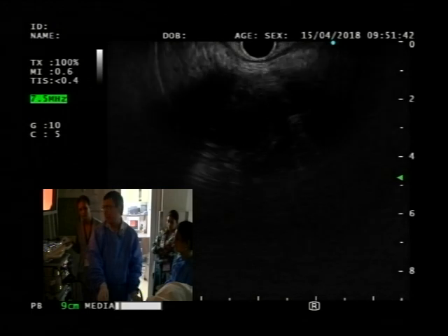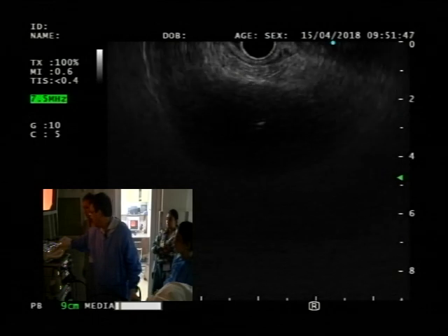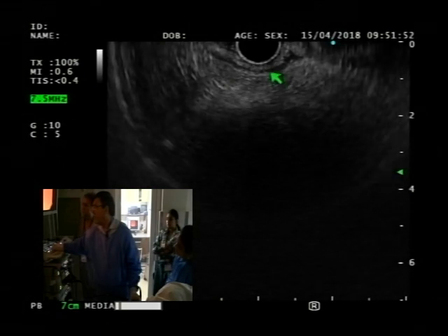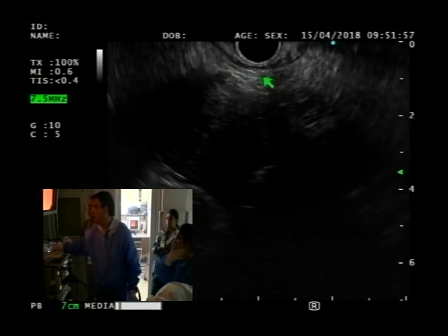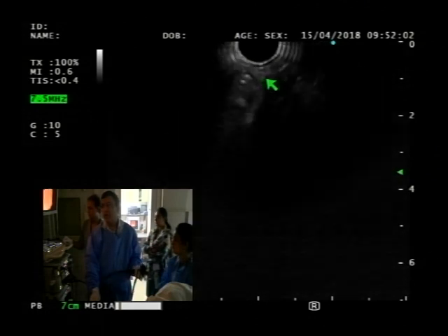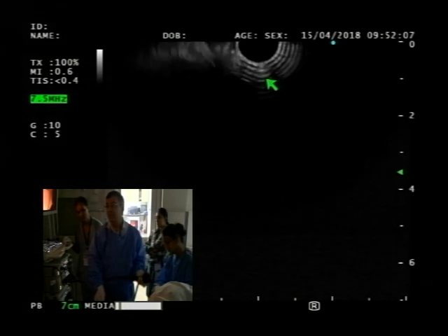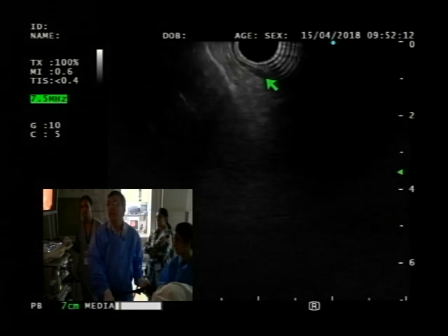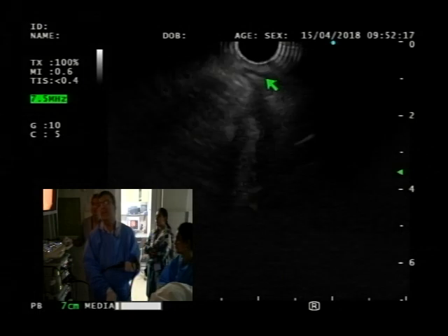with the linear itself. So we still don't see anything. I see the nice walls up here. Right here, you see all the nice walls there. Muscularis is there. Bladder itself right there, and the rest is just fat tissue in between. Now the goal is to go to the area where the tumor itself is, which we saw earlier endoscopically.